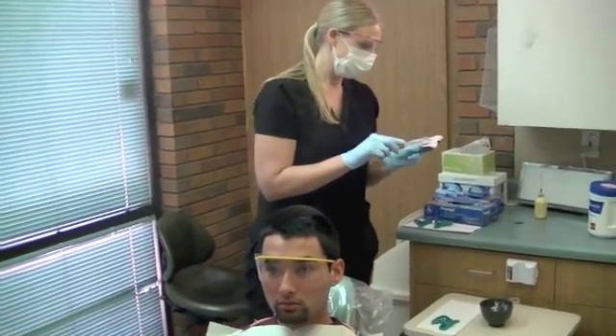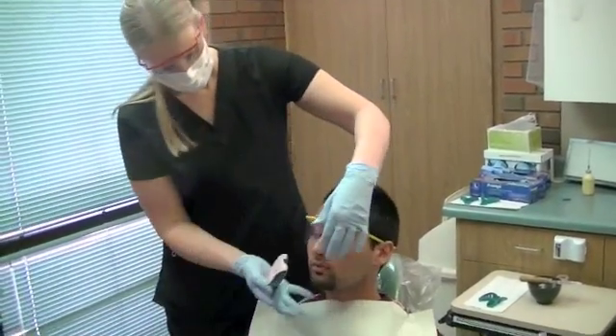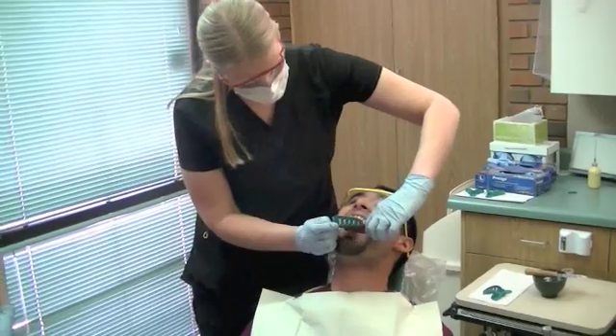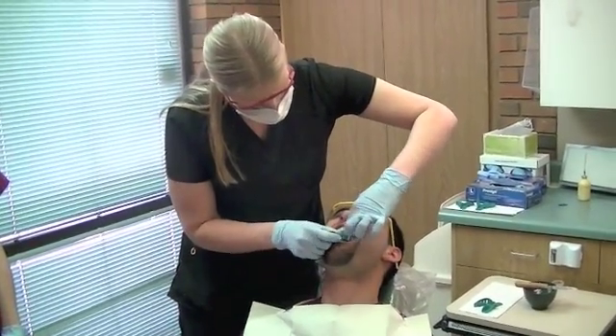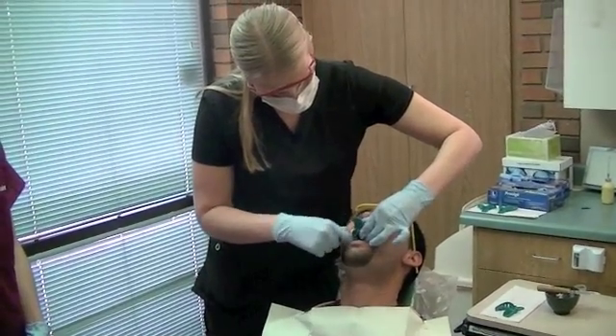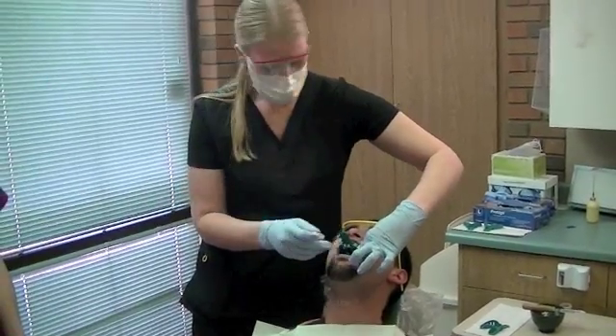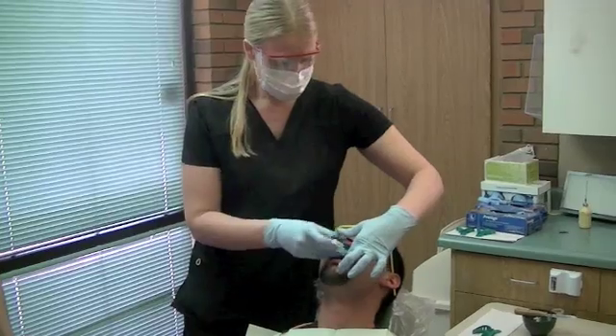Years and years ago when I bought this little automatic mixer, I asked the supply guy why don't you put flavoring in this? He said, well think about it — what happens if you put something with a flavor in your mouth? You're going to salivate like crazy. And there goes your water-powder ratio.